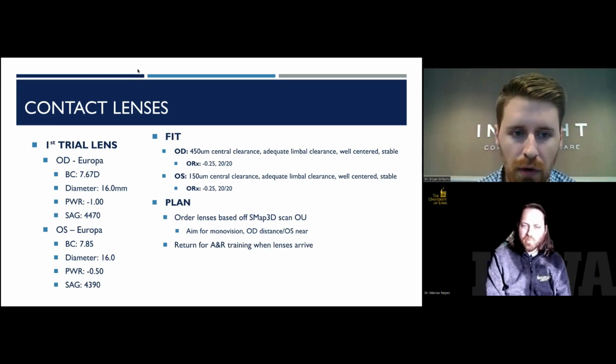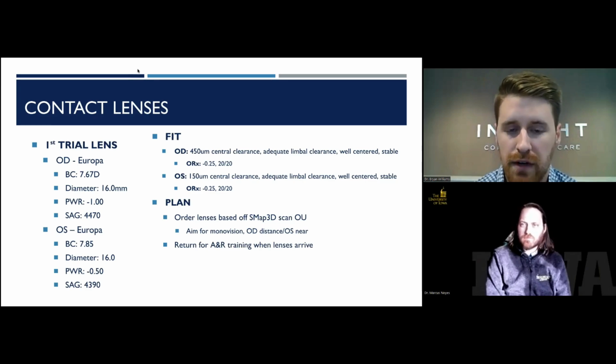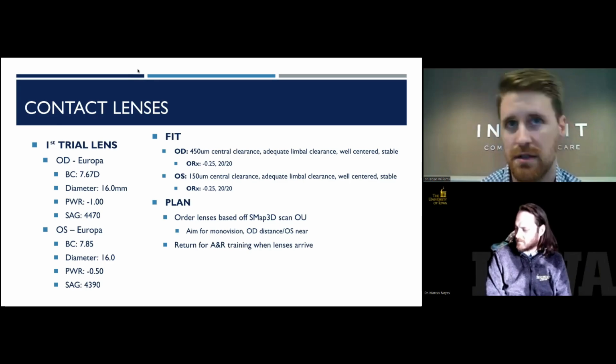So similar to before, I threw on some Europa trial lenses for over refraction purposes. It was kind of funny, she only took -1/4 in office, so it was a really good trial run of how the lenses would feel and relieve some of her symptoms, and it gave her an idea of what her vision would be like too.